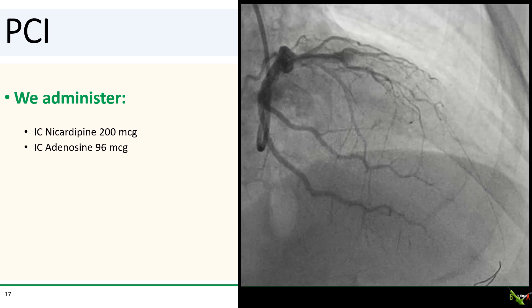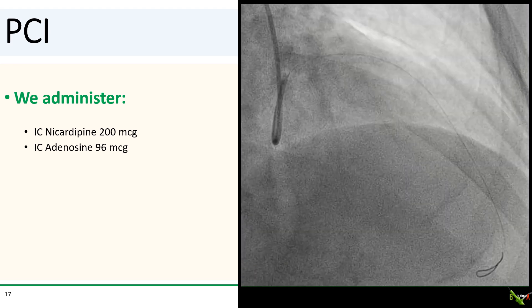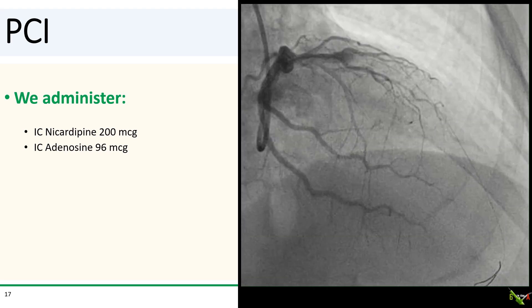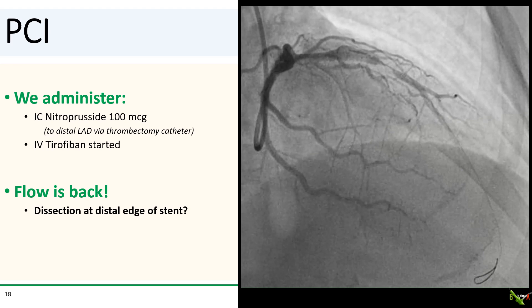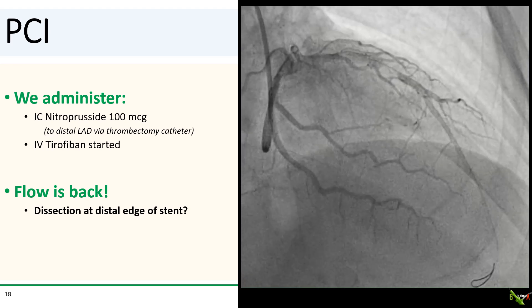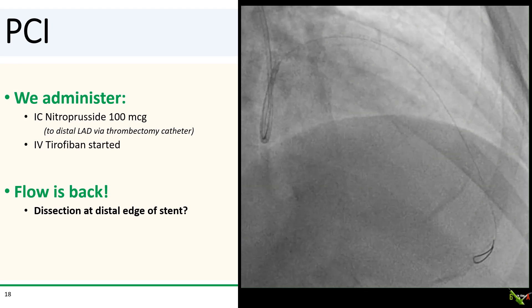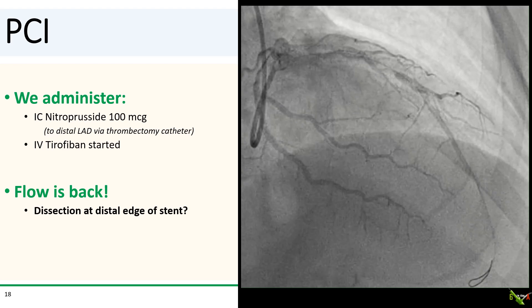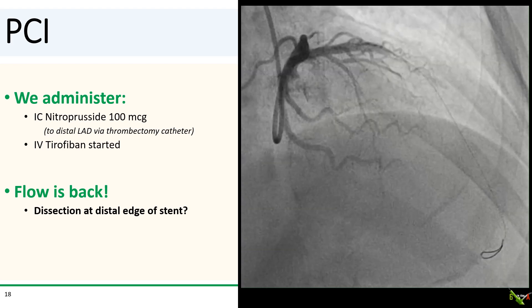Back to our patient. We decided to administer what we had on the table — we gave 200 micrograms of nicardipine and 96 micrograms of adenosine via our guide, but we still had no flow. We then advanced a thrombectomy catheter to the distal LAD and used it to administer 100 micrograms of nitroprusside, ensuring more of it reached the distal vascular bed. We also started tirofiban at this point. Finally, we did get flow back, and it looked like we may have a dissection at the distal edge of the stent — and maybe that's what caused the no reflow.